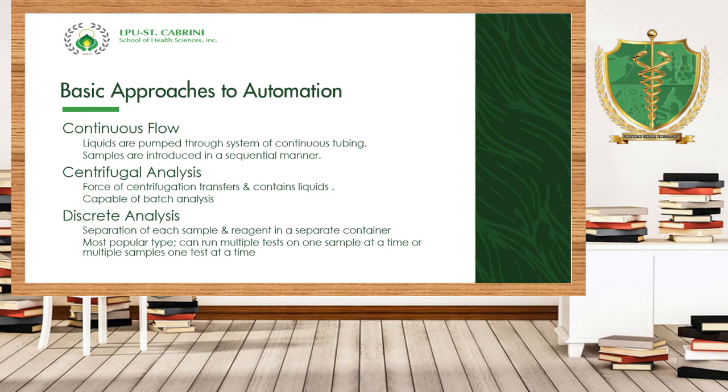Like we said earlier, the AutoAnalyzer is capable of performing 40 samples per hour. Now, what is the problem? The problem in continuous flow is the waste of reagents.